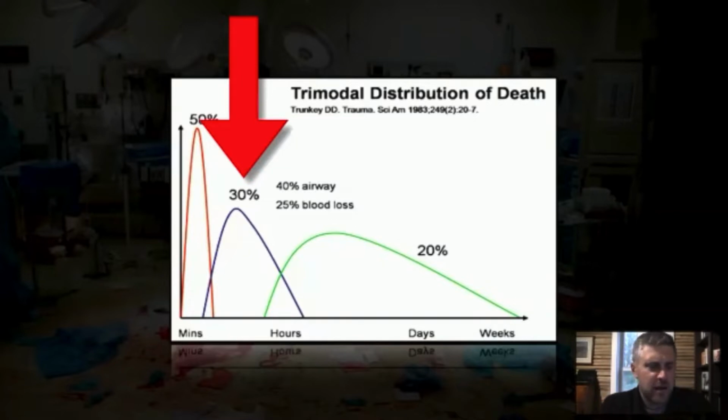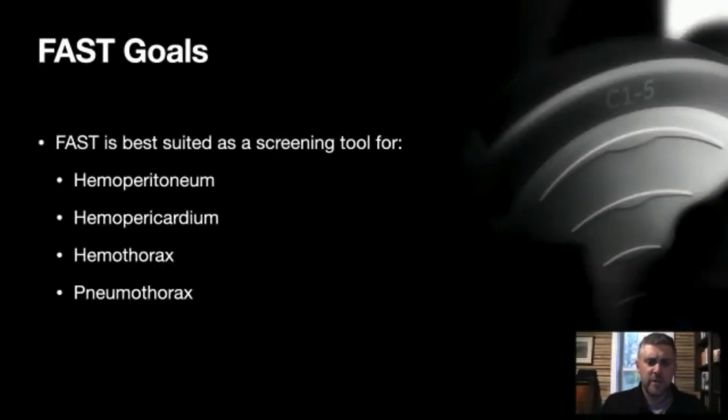I think I ran across something recently. We were talking about how one of the benefits of ultrasound is just finding things and differentiating them early. It allows us to get a head start on the management before the patient decompensates further, and we could ordinarily figure it out without ultrasound. So that's one of the benefits there. But this is the cohort that we're going to focus on. Now, as we get going here, I want to do a brief recap of the FAST exam. Some people may not have seen previous videos or been at previous lectures talking about the FAST exam.